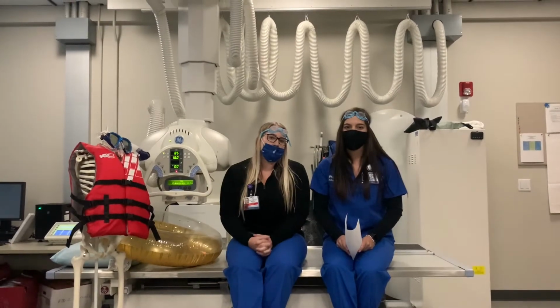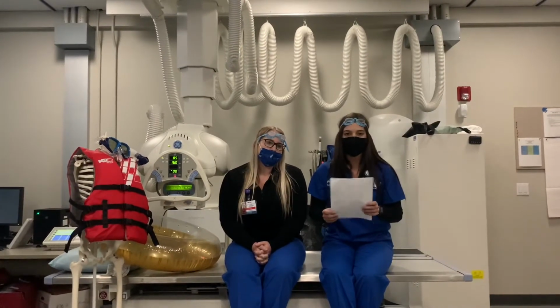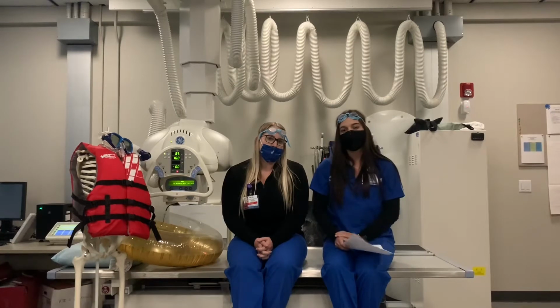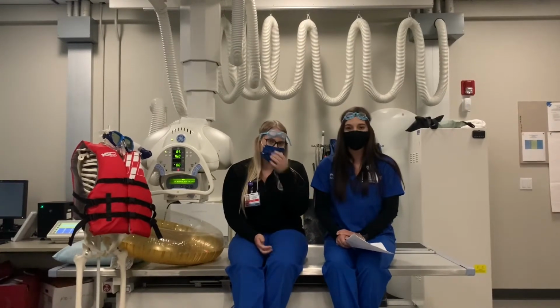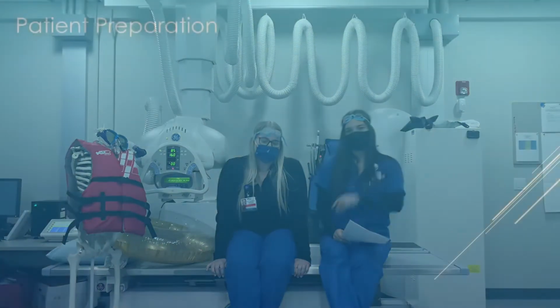Patient assessment begins with the requisition. Once you've received your requisition, you're going to be able to attain a clinical history of your patient. When you go out to the waiting room, you're going to bring your patient in, and it's important to make sure that you get 2 patient identifiers, either date of birth or medical record number. Once you have done that, you begin to change your patient. Now let's go get our patient.